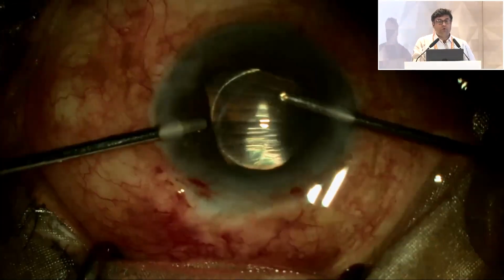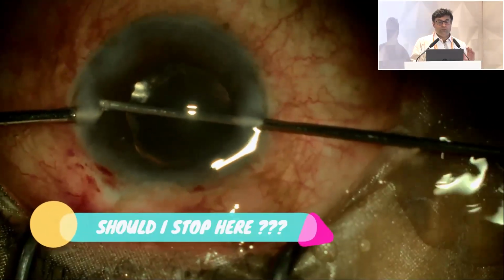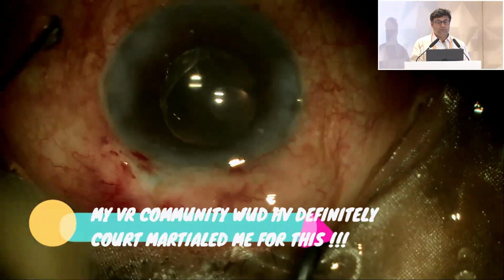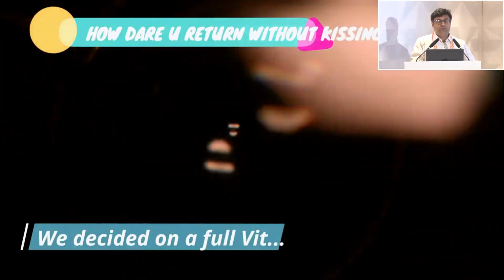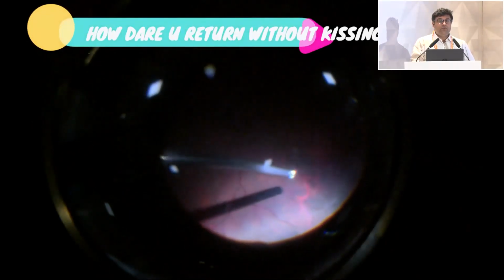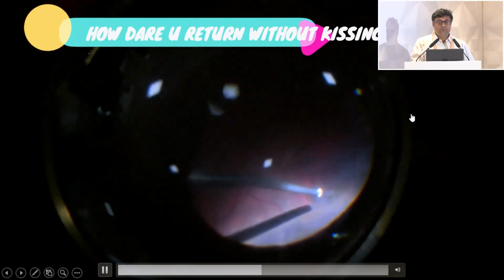Now this is not all. You can get away with doing this, but you don't really need to stop at this. Despite having just a zonular dialysis and no vitreous in the anterior chamber, I still went posteriorly to complete my vitrectomy. And this is the reason why. If you have a PVD that is induced by an eventful cataract surgery, this is what you would have landed up with in the late postoperative phase.